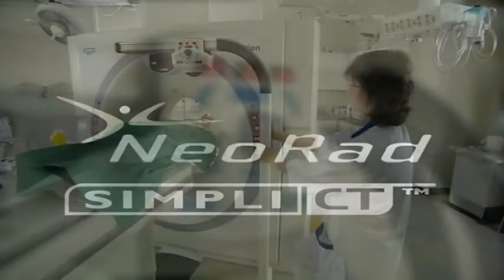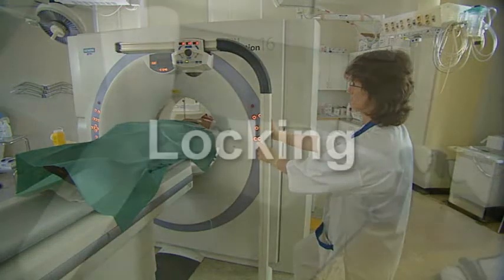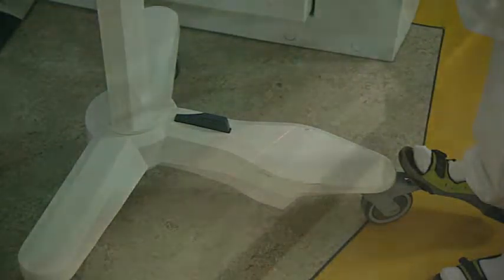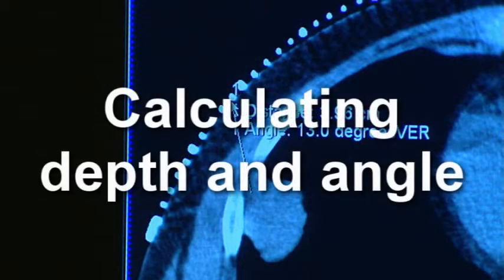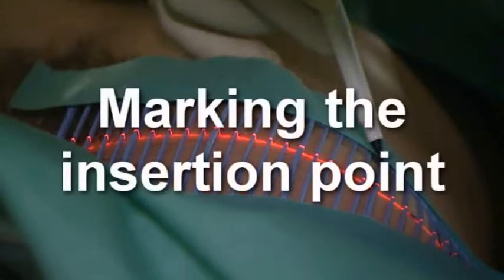Let's go through the various steps one more time. When positioning the SimpliCT, make sure to close the brake prior to aligning the unit. Align the unit with either the edge of the table or the CT laser midline marking. Image the patient. Calculate the angle and distance to the target, and mark the insertion point.